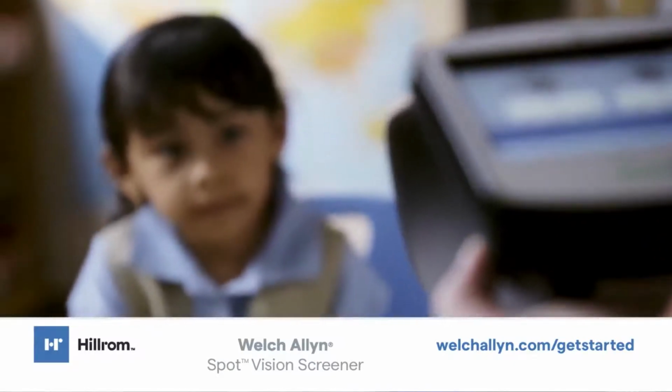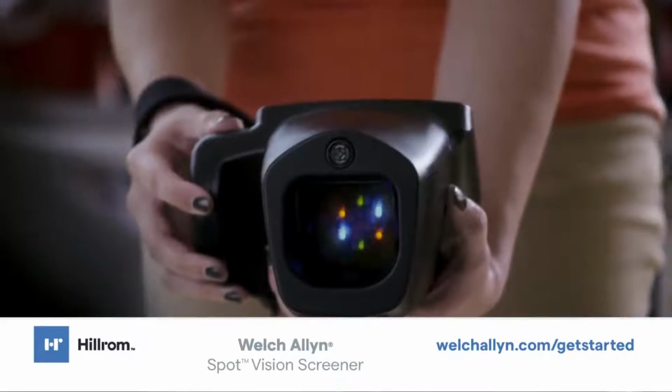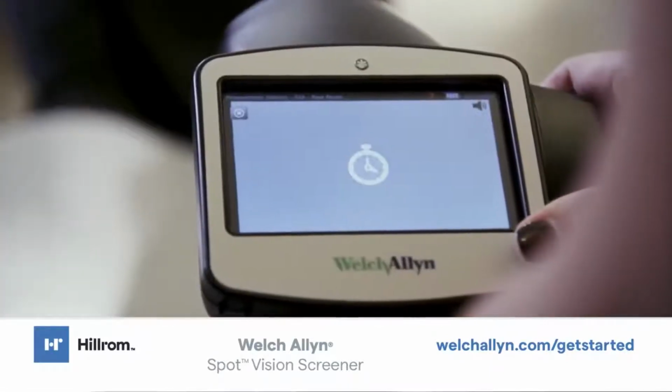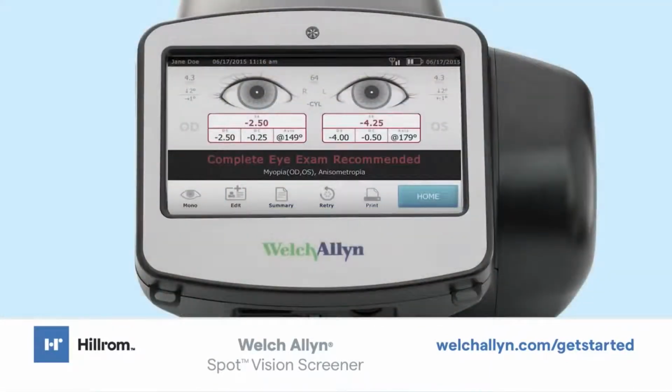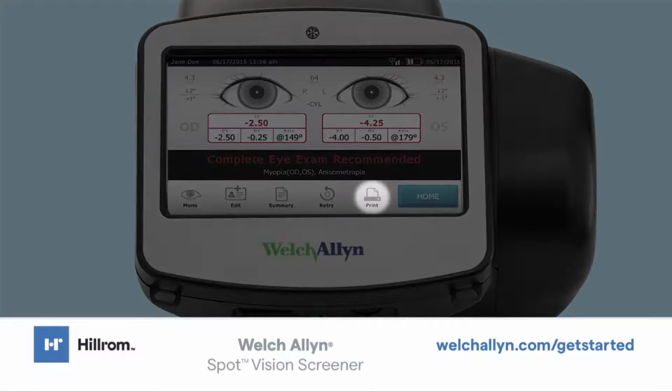The vision screener emits the sound of chirping birds. This sound is intended to focus the subject's attention on the device. The subject results screen appears at the end of the screening process. Completed exams are saved automatically when using this process. A PDF with exam results is also generated and can be printed by touching the print icon.